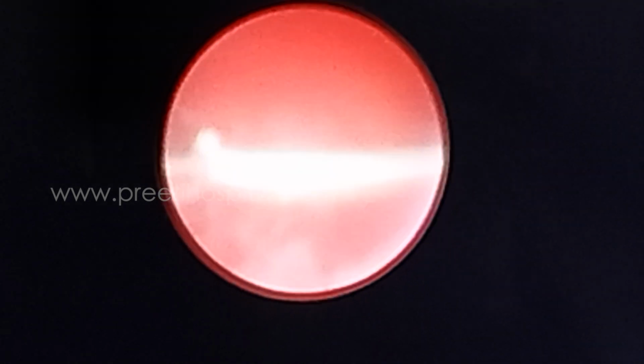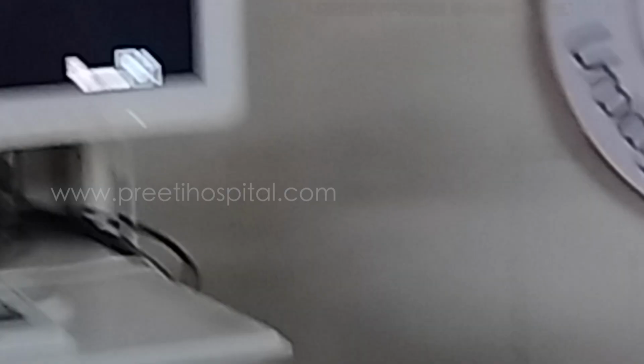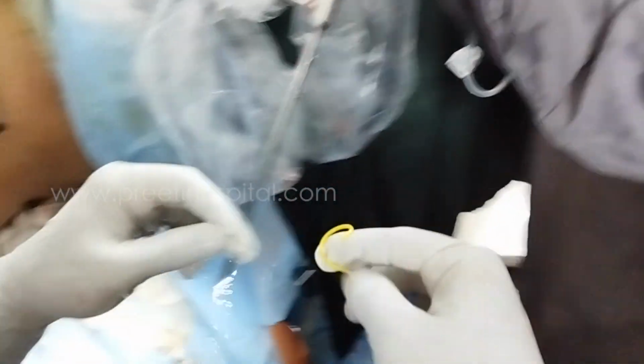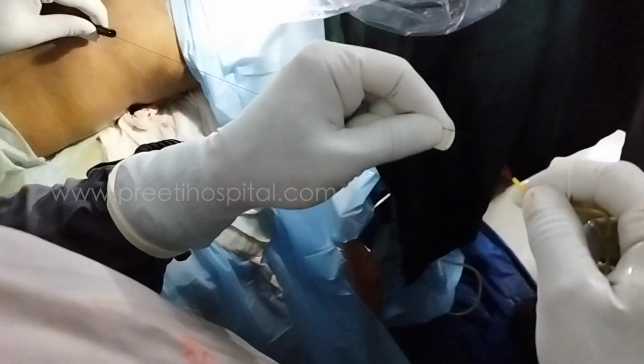So I have not seen because it has come posterior to my Amplatz sheath. Okay? Posterior to my Amplatz sheath. So you should have vision. Withdraw the Amplatz sheath and see. Okay? Now this is there. You pass the stent. Now you take out the ureteric catheter. Stent should be cut. Did you cut that? Yes, sir. Yeah. Withdraw a little bit.